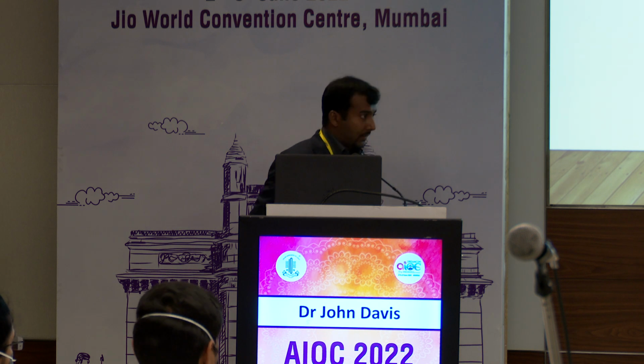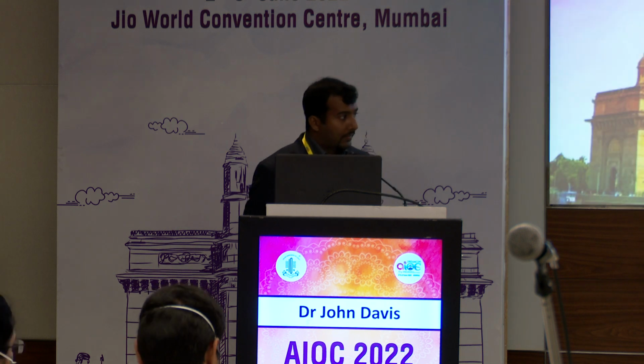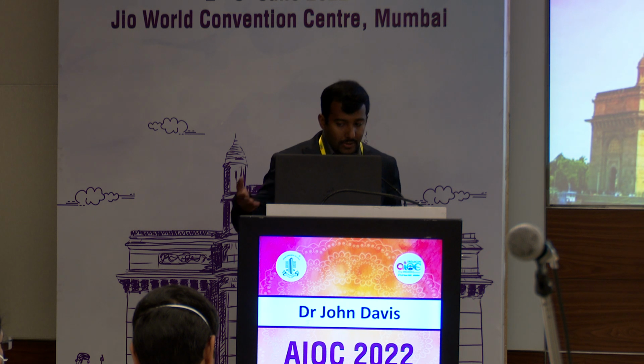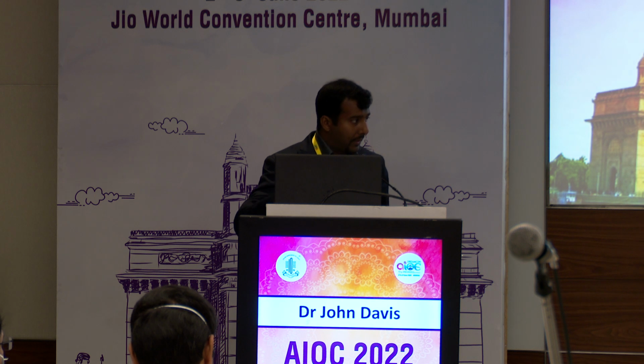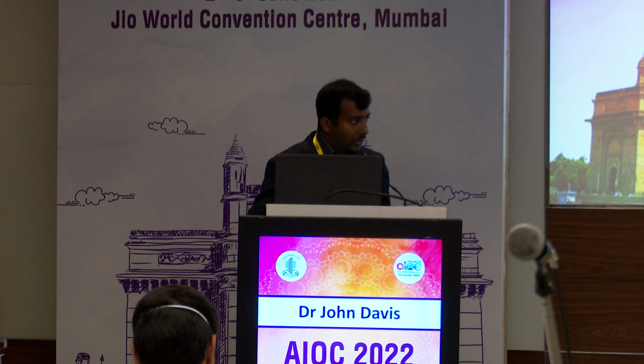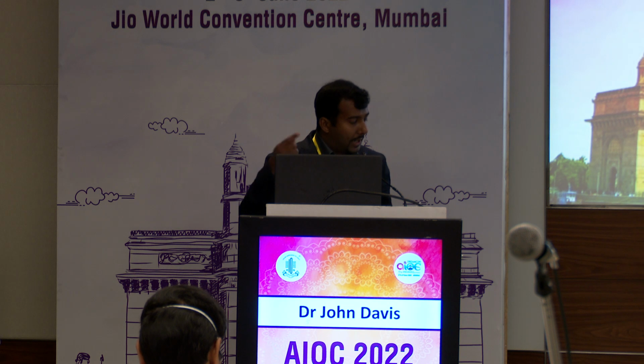So what are the alternative softwares? Are there any other better softwares? Absolutely, sir. If you want to use a commercial AI, in fact, the Medios AI is pretty good. It is on the Remidio Fundus on Phone cameras, no commercial interest. There is a free version which can be accessed through Orbis International's website. Just go to cybersight.orbis.org. If you register as an ophthalmologist, you can upload your own fundus photographs to the site. It will run it through their AI.